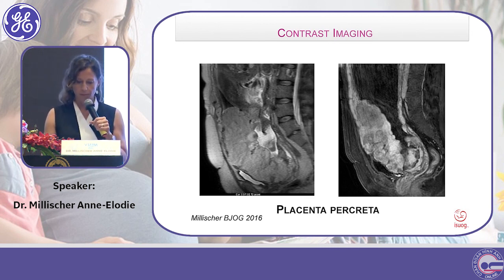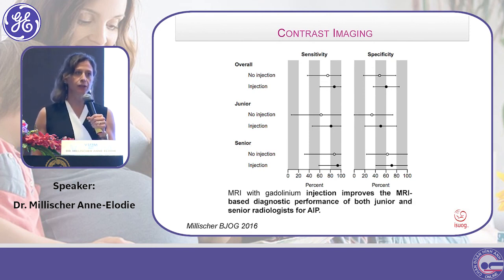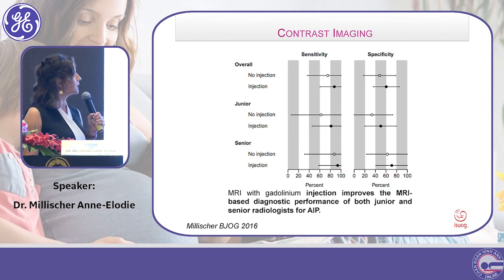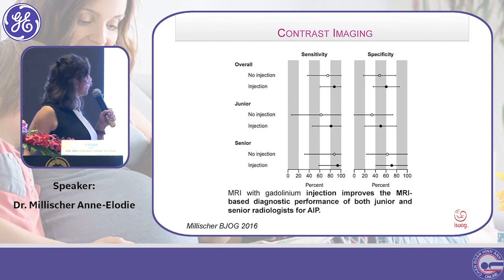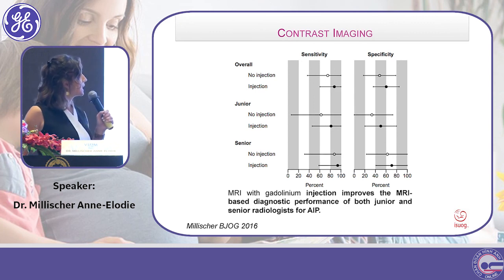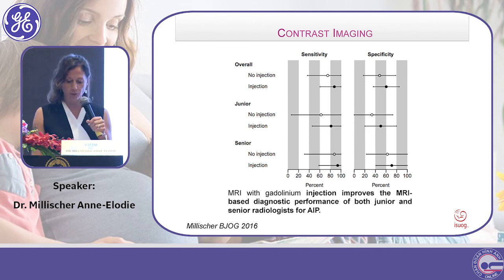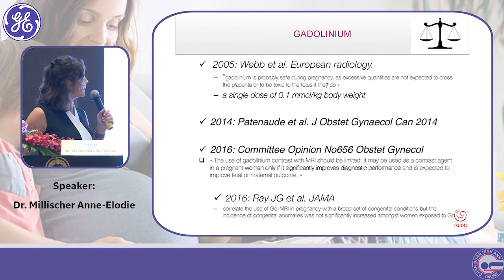rồi mình sẽ chẩn đoán dễ dàng hơn. And we demonstrated that for junior radiologists, with radiologists who are not very experienced in this pathology, the adding of contrast imaging helps them to do a more reliable diagnosis. And it improves also the capacity for the senior radiologist to diagnose placenta accreta with MRI.